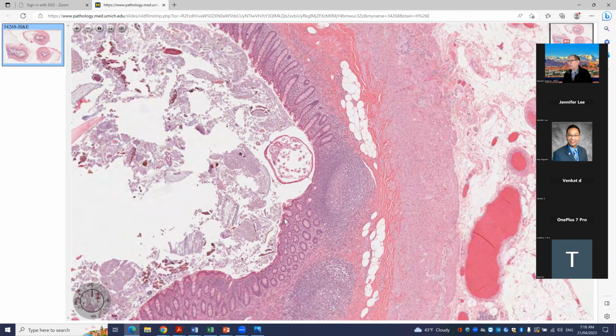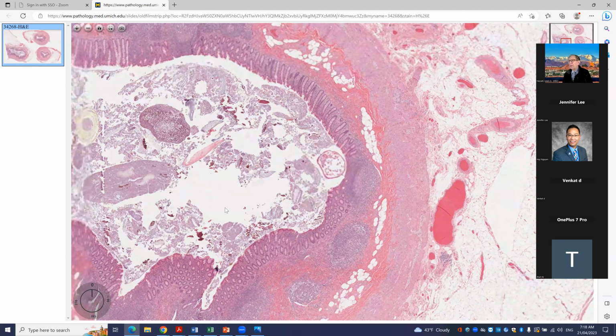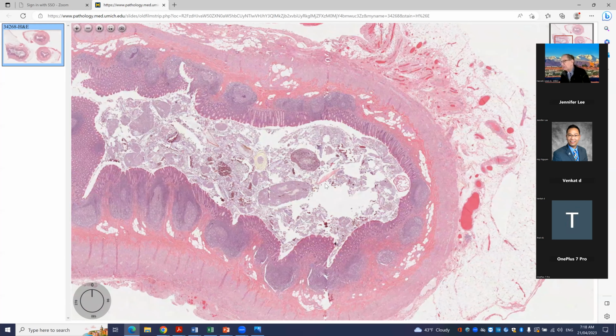And so I'm not sure we have an explanation for his pain per se, but having removed the appendix and made that diagnosis, enabled them to treat him with mebendazole or whichever anti-helminthic drug is in use at the time, should allow the patient to at least recover from that and go on to normal growth and development.